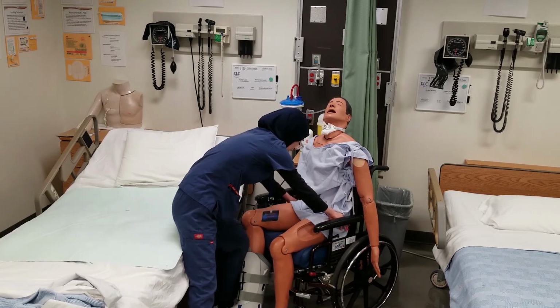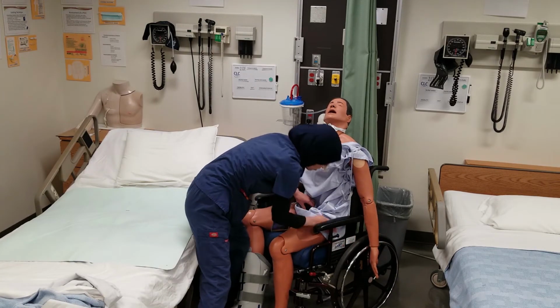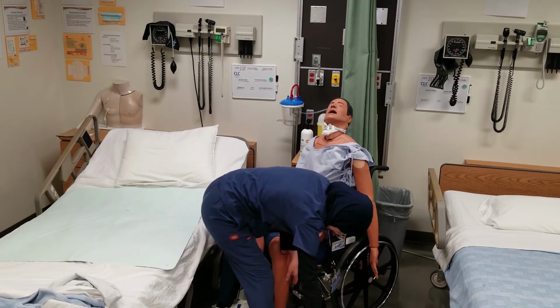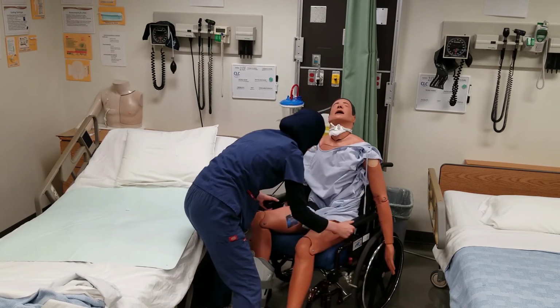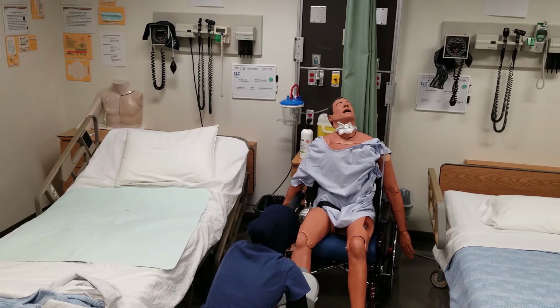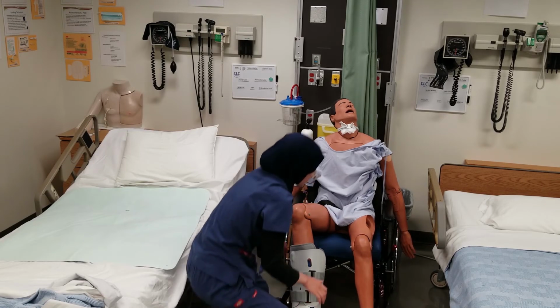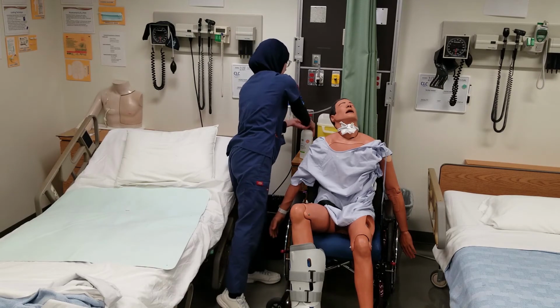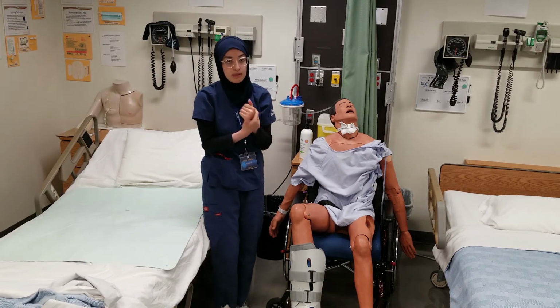If there is a seatbelt, I'm going to lock him in. Alrighty. And then I'm going to move the footrests into place. And then I want to make sure I'm resetting the brakes before I leave. The call bell has to go with the patient, and then I'm going to do hand hygiene before I leave. Again, I want to let the patient know that physio is on their way, and make sure that the call bell is with them before I leave.